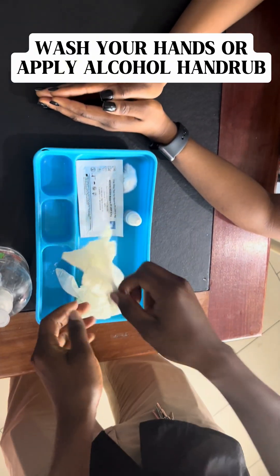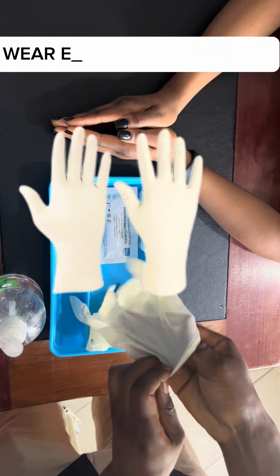First of all, you need to wash your hands or apply alcohol-based hand rub. Wear your examination gloves.